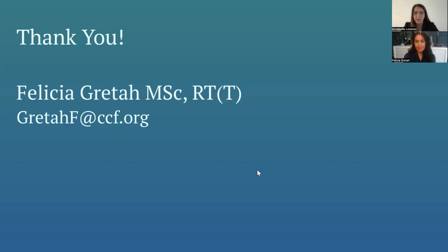Another question is what percentage of patients are deemed unsuitable for breath hold? Good question. It's a little tricky because sometimes you need the physician on board as well to really agree that this is not going to work out, that we can maybe go to a compression route or something different. Often we really try to work with the patient to coach them. I would think about maybe 10% or less. I don't think it's a significant number that we can't.